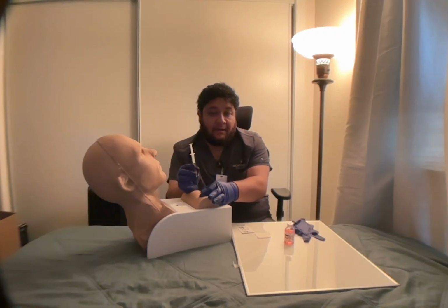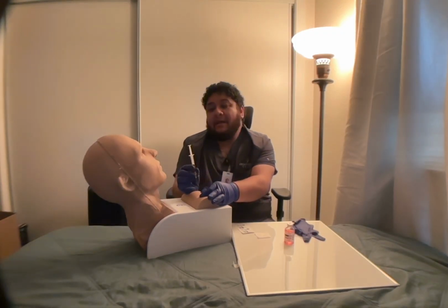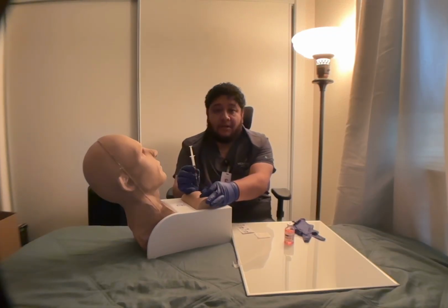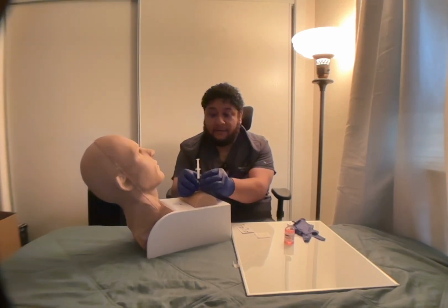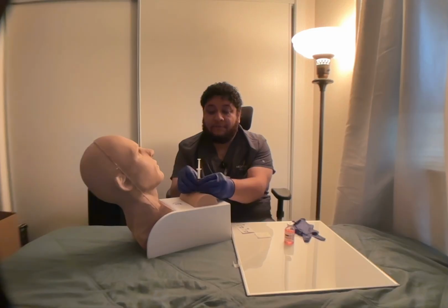Now I have to notify the patient. Mr. John, I'm going to give your injection now, okay? So now I'm going to insert the needle at a 90-degree angle quickly. Okay, now that it's in, I'm going to move my non-dominant hand to stabilize the syringe.